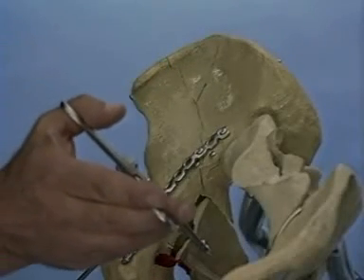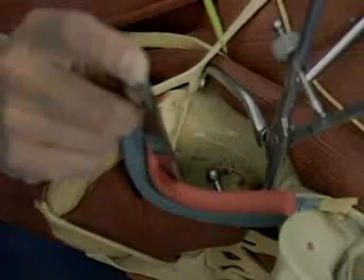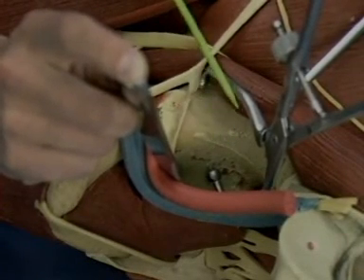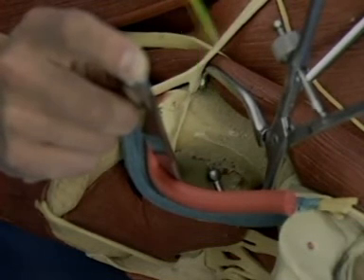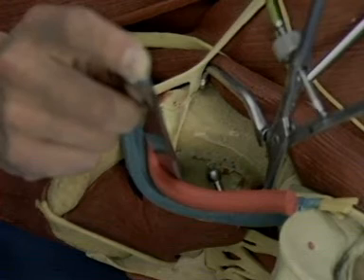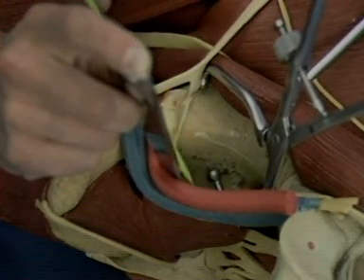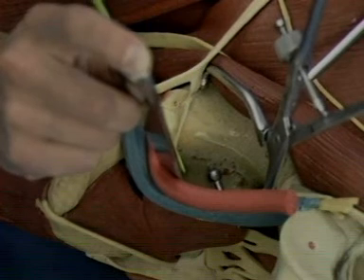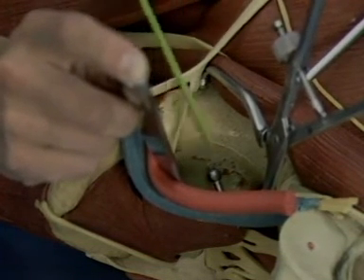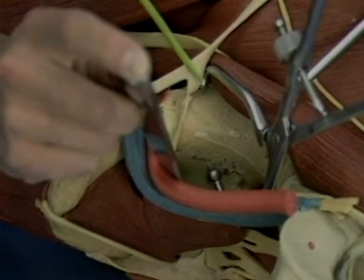The posterior column fracture site is now reduced with angle jaw ball-tipped reduction forceps. The small angle jaw clamp is placed in the second window of the ilioinguinal, just medial to the iliopsoas and the femoral nerve, and just lateral to the femoral vessels. One tip is seen on the quadrilateral surface, the other tip near the pectineal eminence.